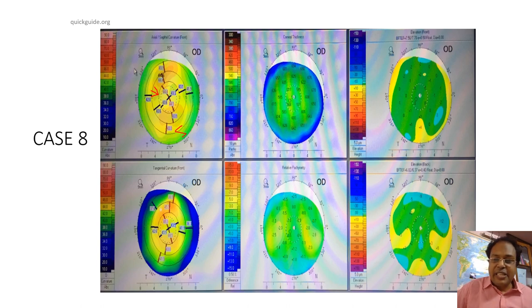Again, that irregularity, in session one we were talking about, it could be structural, it could be because of dry eyes, but I'd say that it may be more because of the dry eyes, because I don't have much of an astigmatism, only 0.5 to 0.75 diopters. And with very low amounts of astigmatism, this could often be irregularity caused by some form of dry eyes, which maybe in my case is largely asymptomatic.